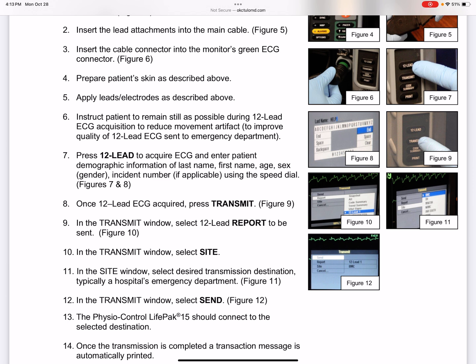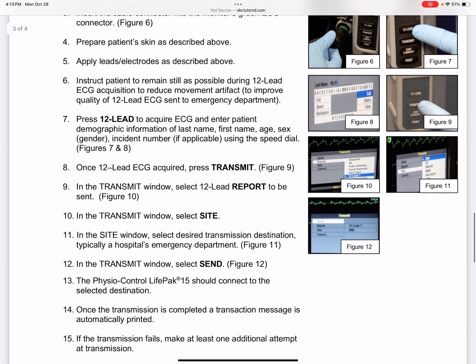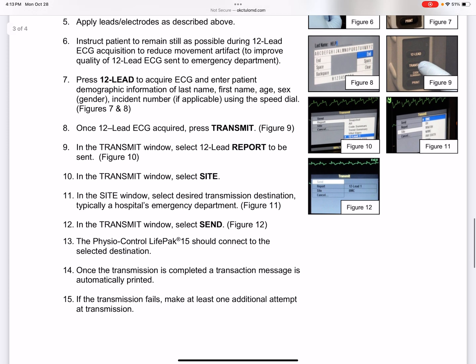With that being said, we do not do that very much anymore. The ambulance side of the fire department will use ESO alert, where they can attach their 12 leads and send them that way. And the fire department, we don't usually transmit 12 leads anymore anyways, because we have the ambulance now. So that's how you do that.